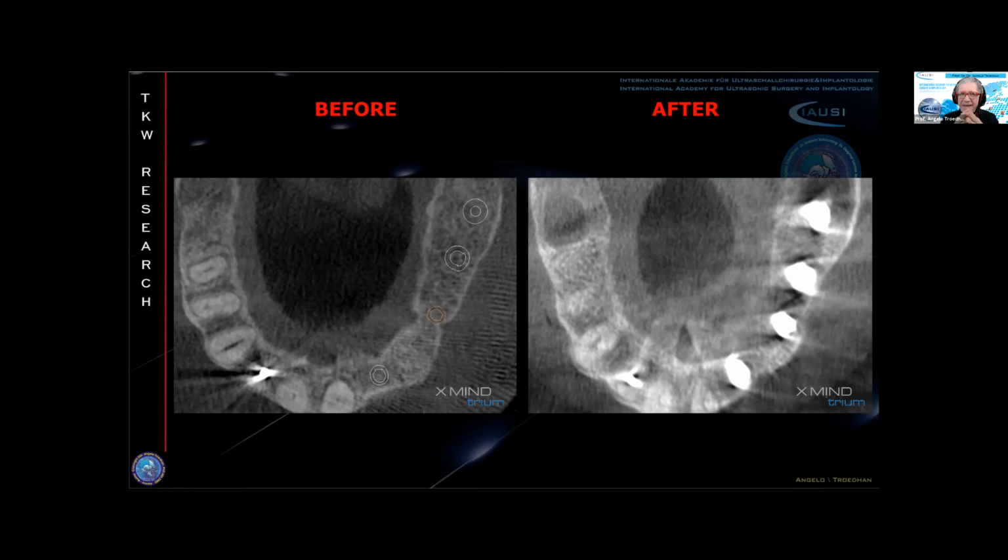And only later on, if you tackle very complicated cases where the question is, can I avoid a bone augmentation procedure at all if I place the implant slightly here or slightly there, if I can use angulated implants, for instance for bone augmentation-free procedures, all-on-4, all-on-6, etc., with angulated implants under the sinus cavity, there of course you obligatorily need surgical guides, because this type of angulation you cannot do with your eyes. But you see, the result is quite satisfactory.